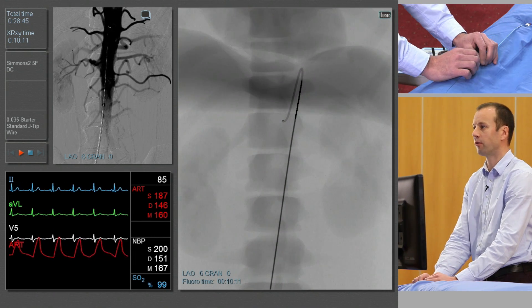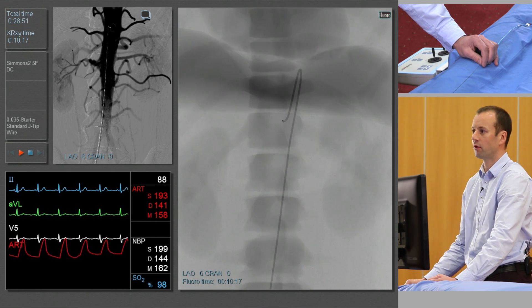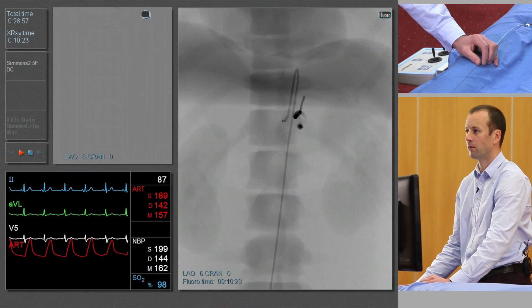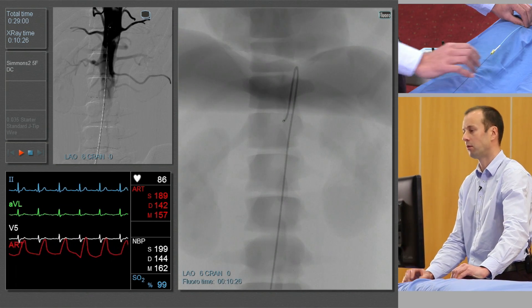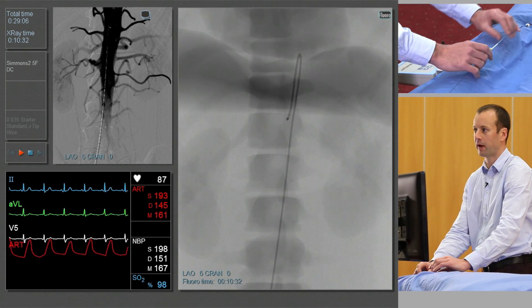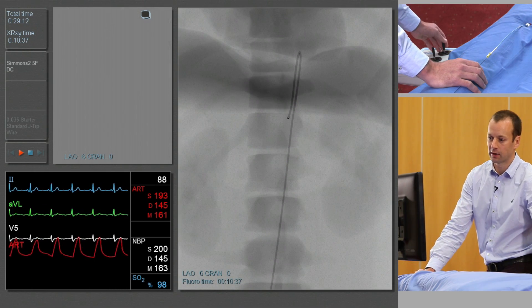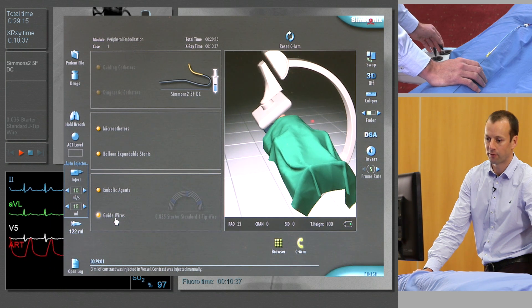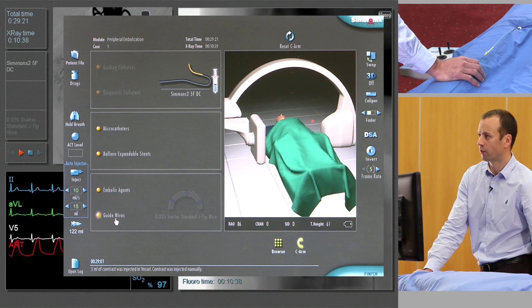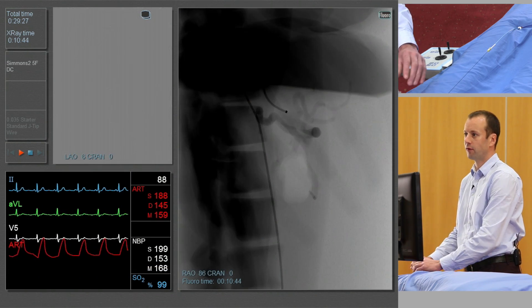You can see it just starting to deflect. We're going to remove the guide wire and confirm that by injecting a little bit of contrast. Push it back out a little to see a bit more, and there we can see the celiac branching into the hepatic and the splenic arteries. We can get a better view by angling the image intensifier to get a lateral view of the patient. This vessel comes off anteriorly. Another small injection confirms that this is the celiac.